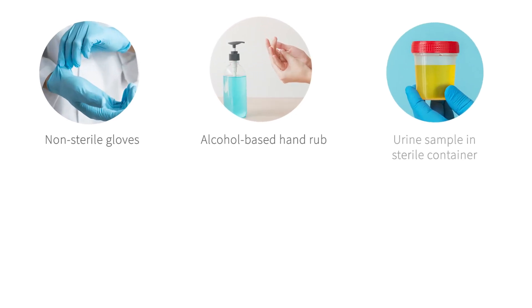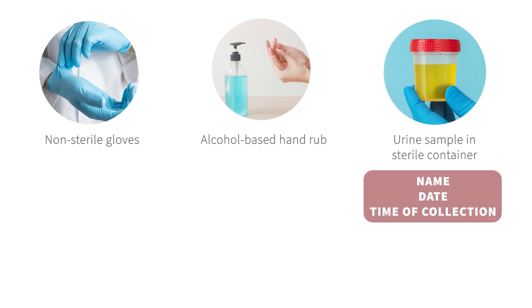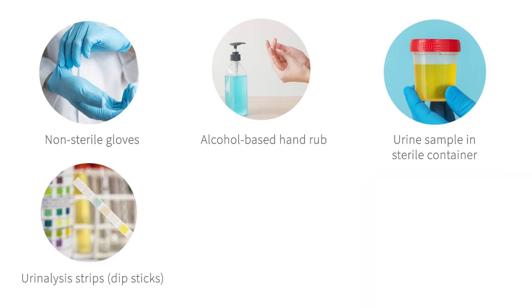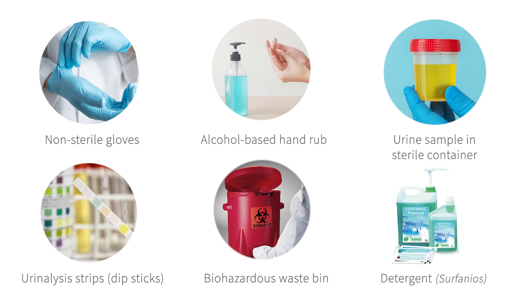Now it is time to begin gathering the equipment. We will need non-sterile gloves, alcohol-based hand rub, and a urine sample in a sterile container. This is where we should confirm the label has the patient's name, the date, and time of collection. The urinalysis strips — it is important to check that the reagent sticks have been stored according to manufacturer's instructions and are not expired. The biohazard waste bin. And a detergent or disinfectant for surfaces, such as Syrfanios, which should be clearly labeled with a date and should not be expired. Gathering our equipment ahead of time helps minimize disruptions during the procedure, which ensures the accuracy of the results.